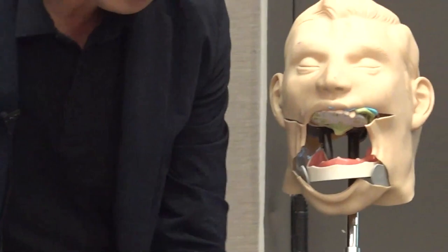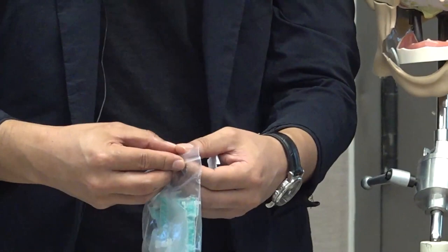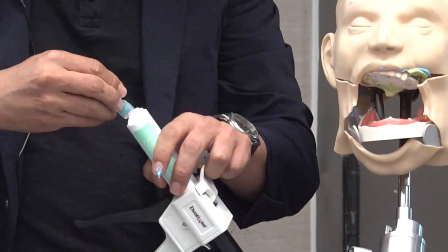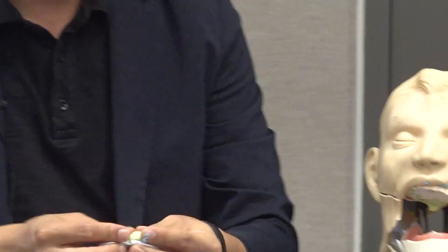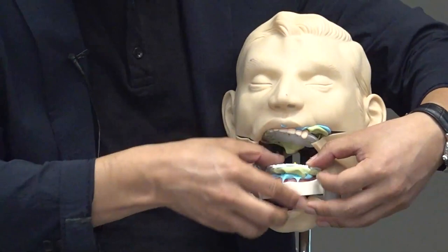If you have enough experience, this procedure will be finished within 10 minutes. Yes, no need for a long time. And then, when you position the lower, there is no other consideration. You put it simply like this, okay?